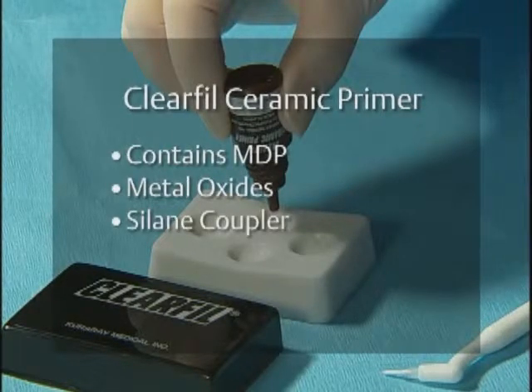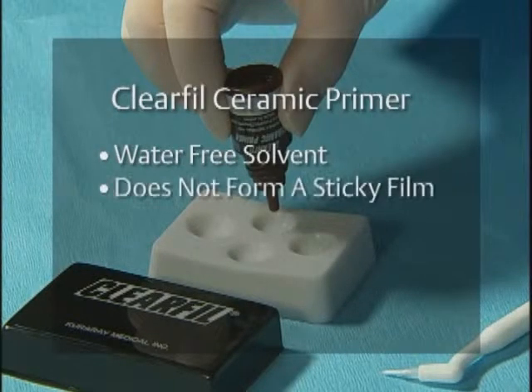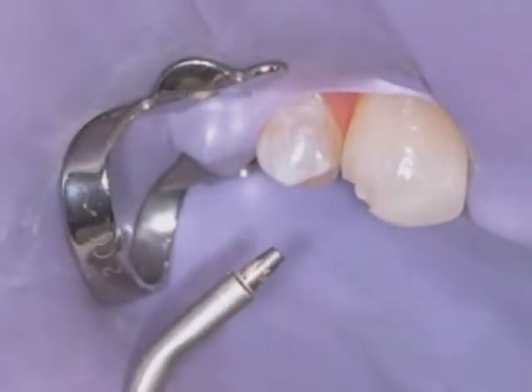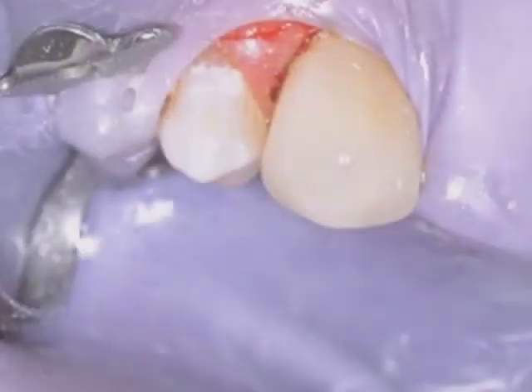Clear Fill Ceramic Primer also contains a silane coupler to bond with silicon dioxide-based ceramics. It is very easy to use — it does not require mixing, uses a water-free solvent, and does not form a sticky film. Its formulation provides better shelf-life stability compared to other single-component products. Clear Fill Ceramic Primer can even be used to repair broken ceramic restorations simply, easily, and intraorally without having to use dangerous hydrofluoric acid. Simply sandblast the porcelain, clean with phosphoric acid, rinse, and apply ceramic primer. Nanofill or microhybrid composites will bond to it with no bonding agent. No one else has this technology.